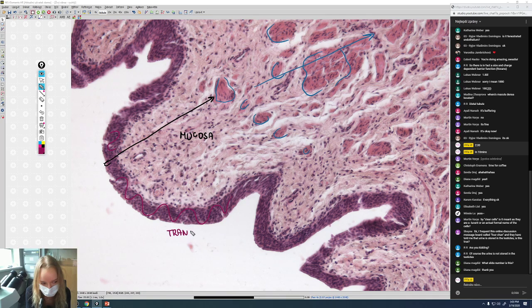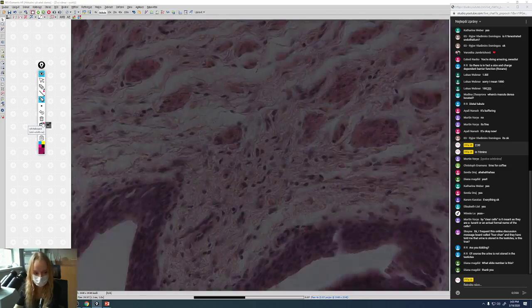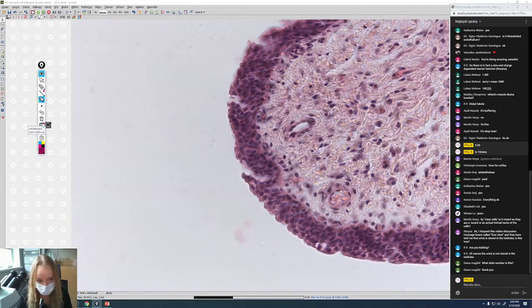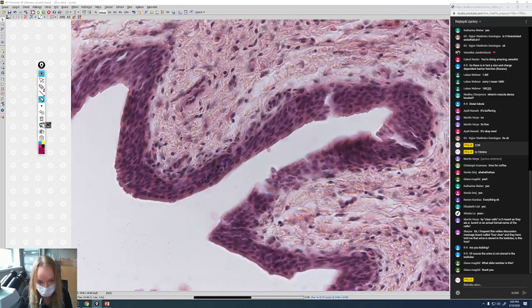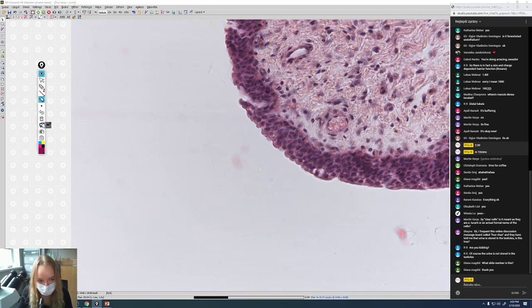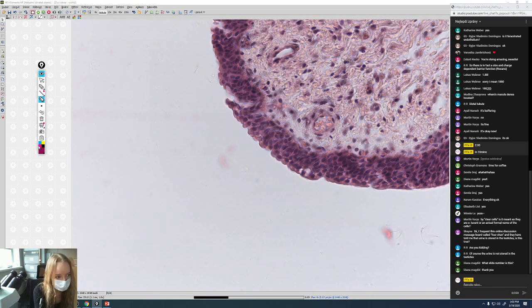You already know this epithelium. We described it in the calyx of the kidney, but right here, we're going to focus a little bit more on it. Hopefully, we can see some pretty umbrella cells here. I can see them already. I'm not able to find prettier ones, but yes, the apical cells here are umbrella cells. These are quite good umbrella cells here. So, normal transitional epithelium.